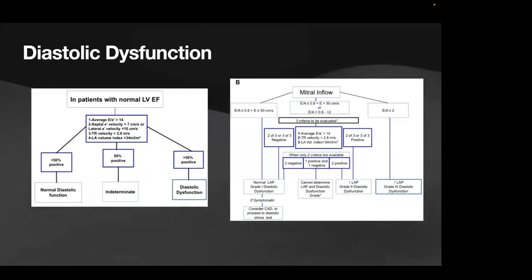Kathy says here, can we look at the pulmonary vein Doppler pattern to comment on LA filling pressures? Yeah, so it's another aspect of this that's in the guidelines. It's not within these flow diagrams, but you absolutely can. From what I've read, and please, anyone on this call can correct me if I'm wrong, it's good in its extremes.